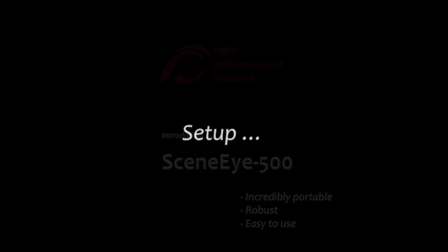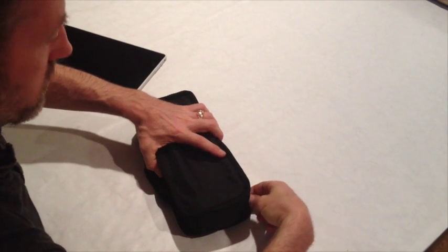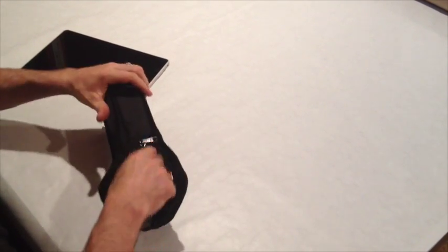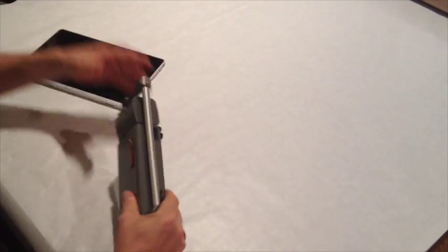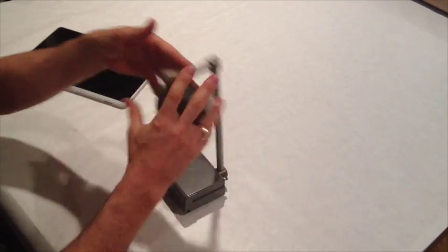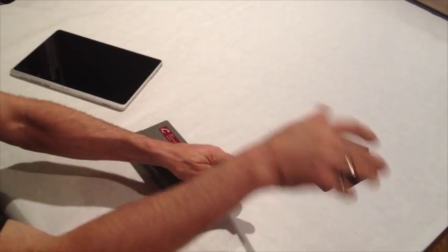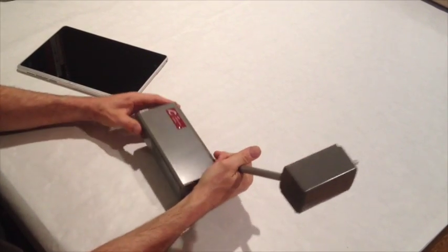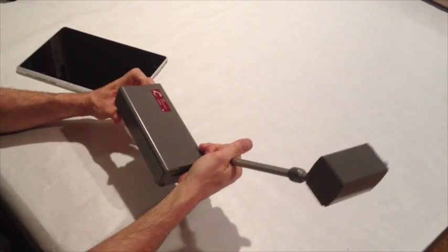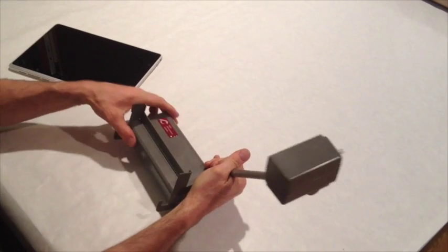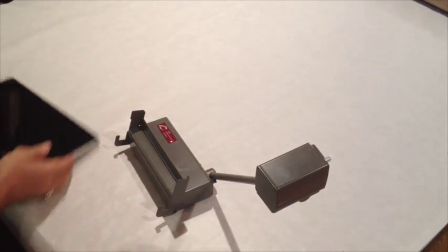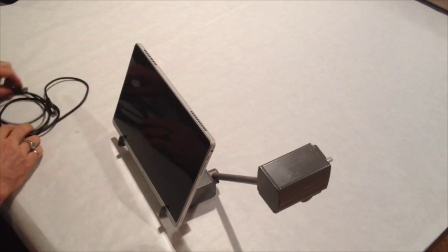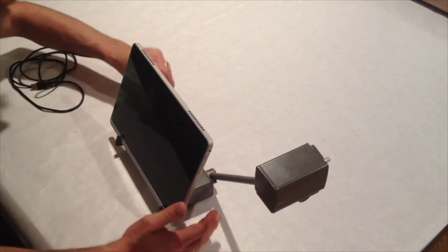Let's take a look at how easy it is to set up the SceneEye-500. First, remove the camera from its bag, set it on the table in front of you, and with a few quick, easy motions, you're set up and ready to go. The tablet support simply spins out from underneath the base of the camera. Plug in USB and that's it.